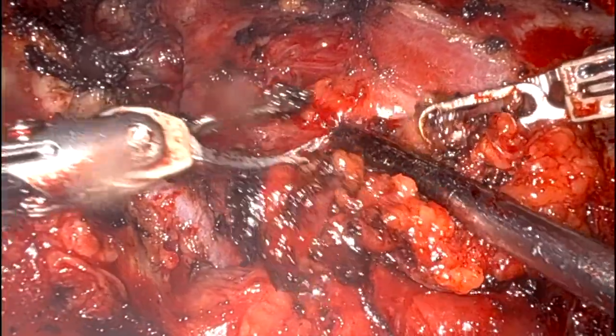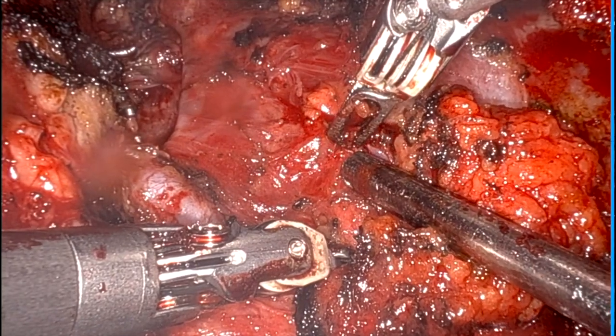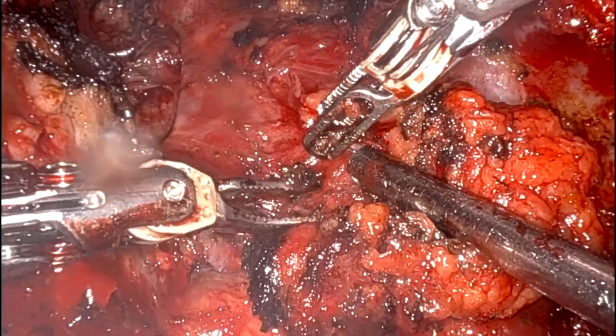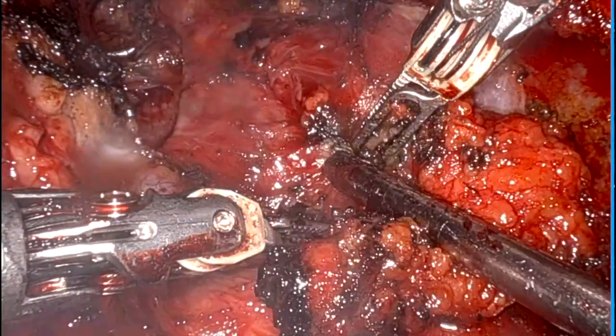This is again an example why I love bipolar cautery in both my hands. Look how easy it is, if you have bipolar in both right and left hands.